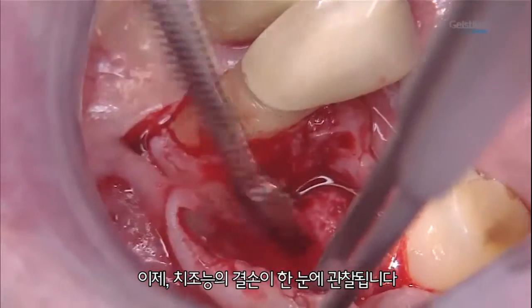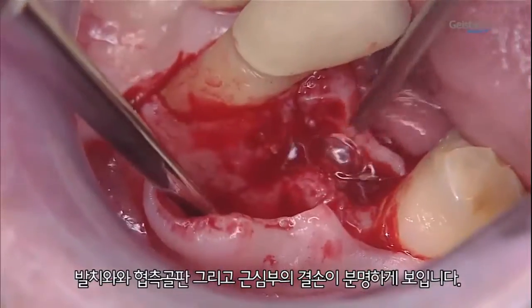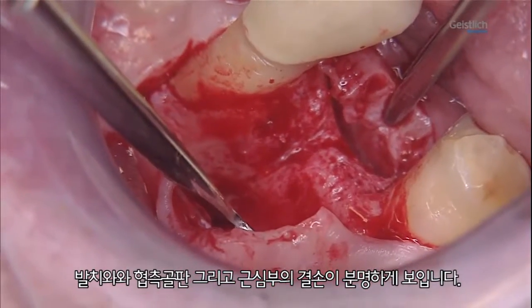The ridge defect now comes into view. The extraction socket and the buccal bone plate, with some tissue loss in the mesial area of the defect, are clearly visible.